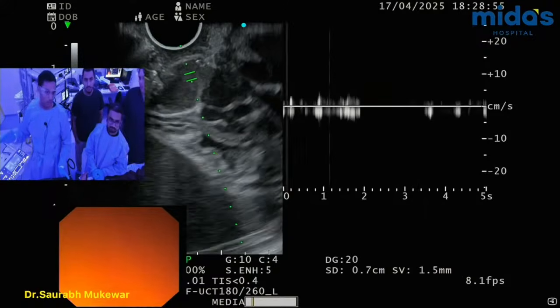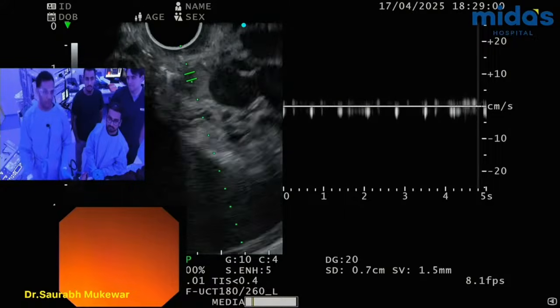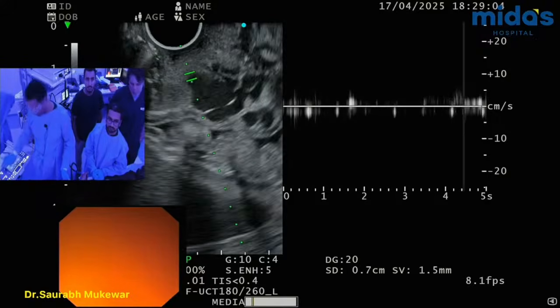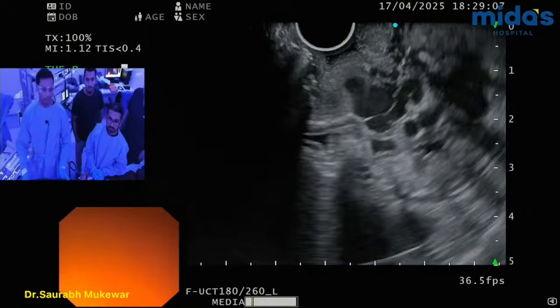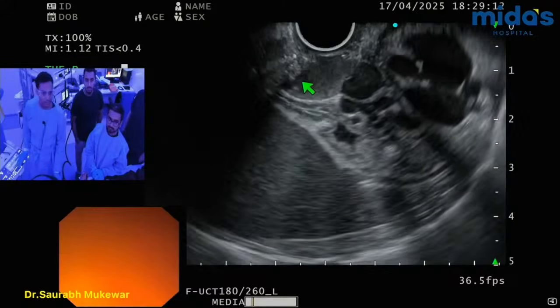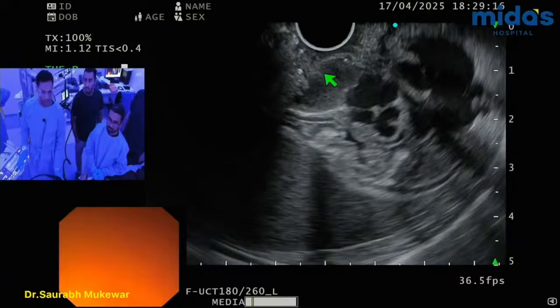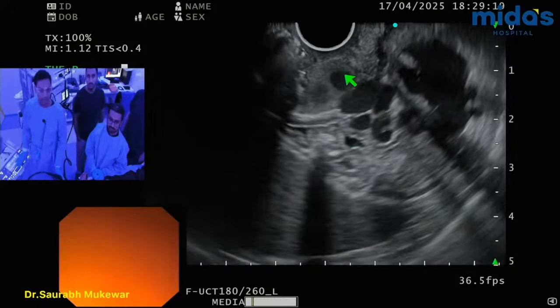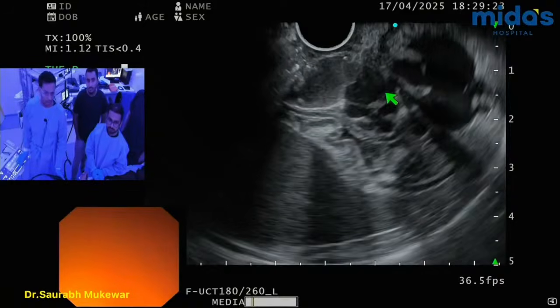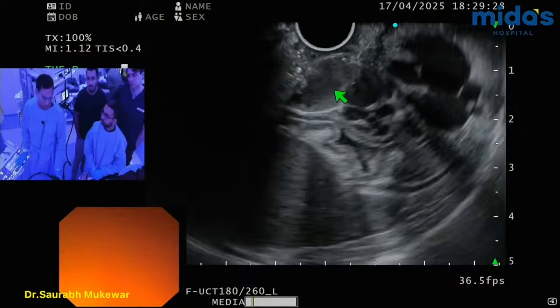Right, so it's so small, it's like 2-3 centimeters per second. So whether we need to do it or not is truly debatable, because this is all there is left, right? And there's very little flow here. See here? And this flow is 90% reduced right now. And this is going to go out from here and then exit from there, the blood, right? So whether we need to address it or not is a good question.